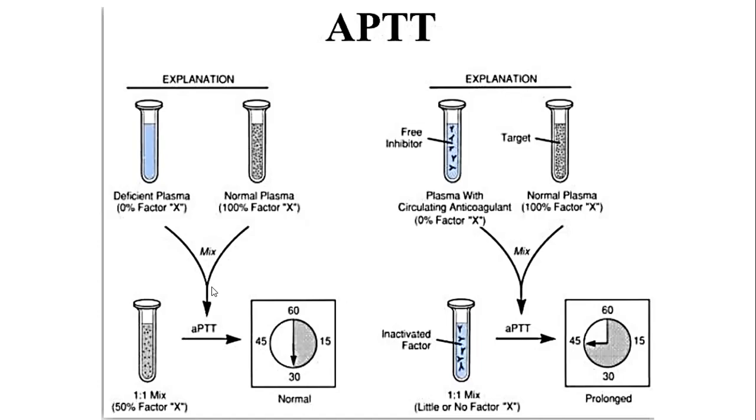Right? So we try to determine kung ano manggid ang clotting factor nga deficient ang sample, or ano nga klase nga clotting factor ang wala sa sample. And we do this by trying to mix two types of plasma. The plasma which is deficient of a specific clotting factor, and we also mix it with a plasma nga normal.